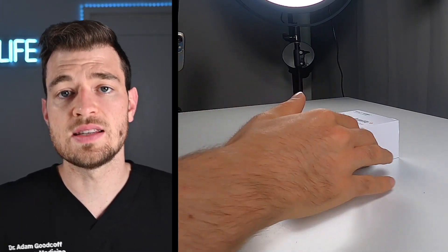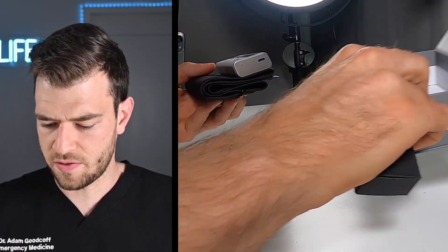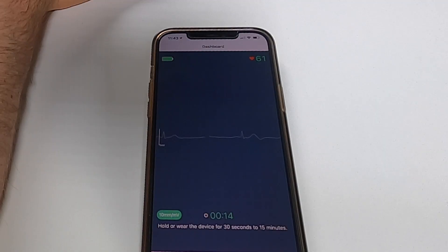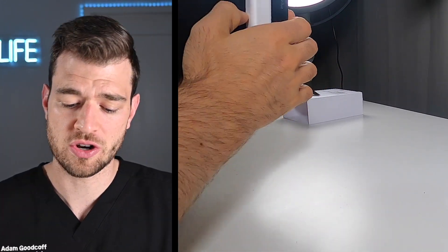This is the ArmFit blood pressure monitor. We're going to take it out of its case now. Looks like we have a blood pressure cuff and a charging cord. It powers on and actually has the correct date and time showing. It has Bluetooth connection, which will allow us to hook it up to our phone and receive our measurements. Let's go ahead and test it out — let's try a blood pressure.